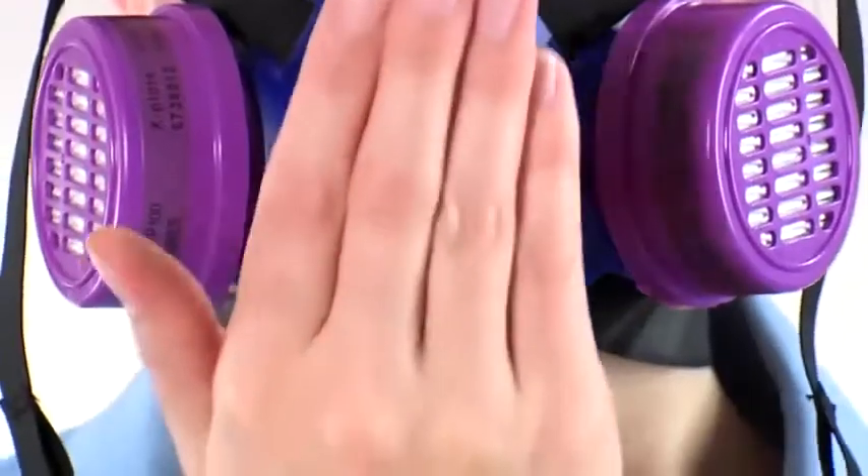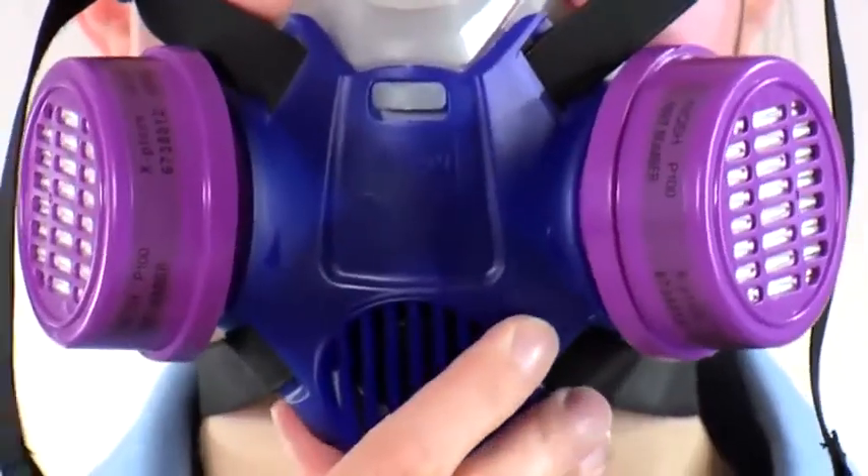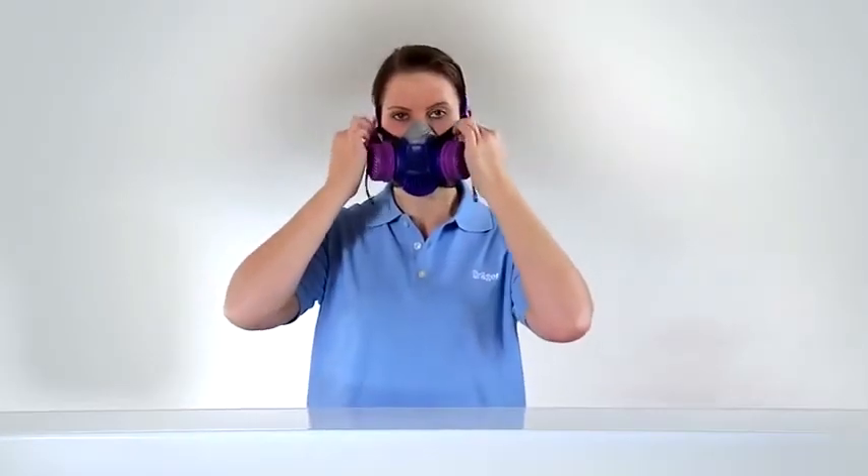For the positive pressure check, seal the exhalation valve with the palm of your hand and exhale. The half mask should inflate slightly. If the exhaled air leaks out of the mask around the sealing line, reposition the face piece and adjust the straps.